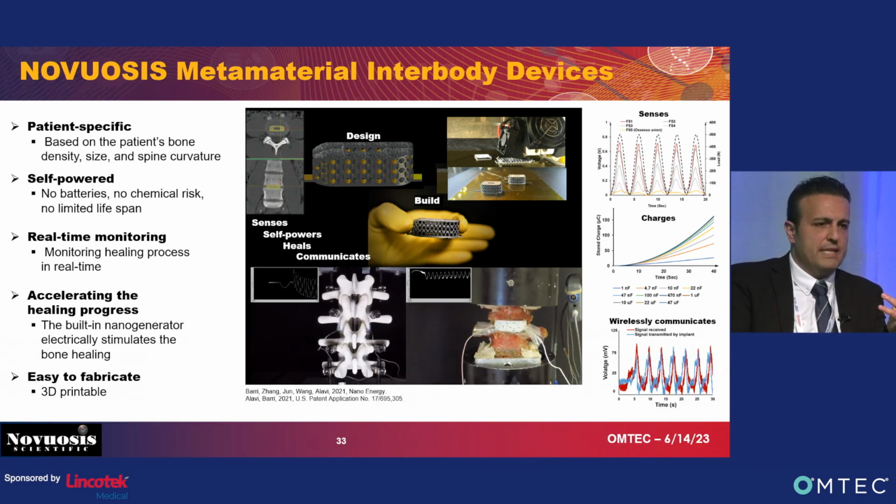And what we are doing right now, we are exploring other applications for this in different areas. Like we have designed a cardiovascular stent based on this concept. We have designed a plastic insert in the TKRs. Actually, we are right now working on that one. And I guess there are a lot of other applications, and there are, of course, a lot of challenges that we are going to talk about hopefully after this.